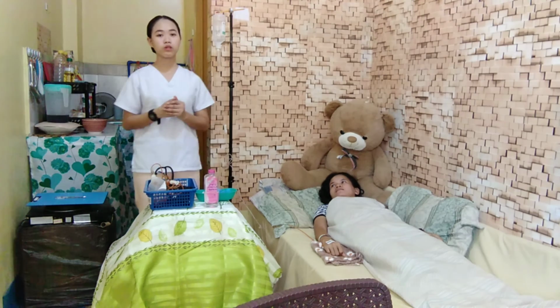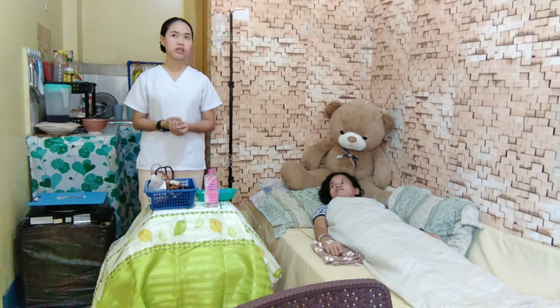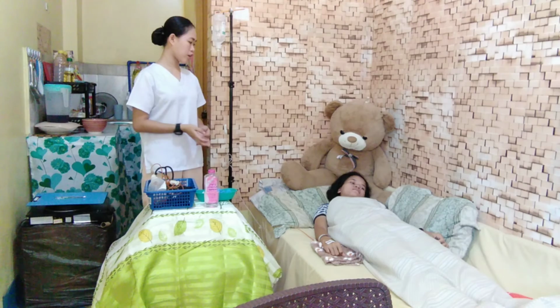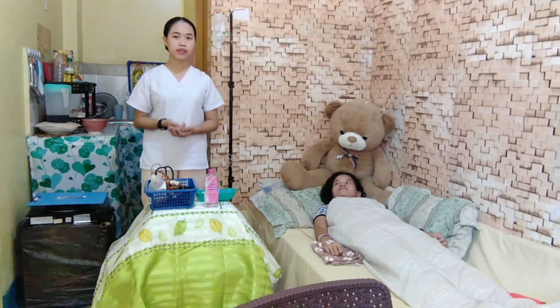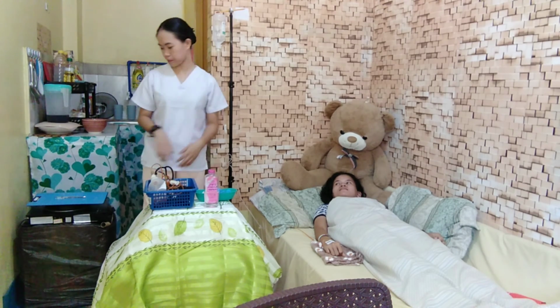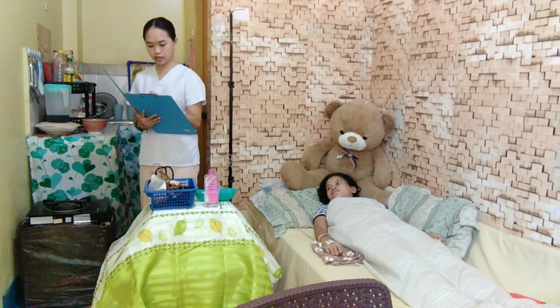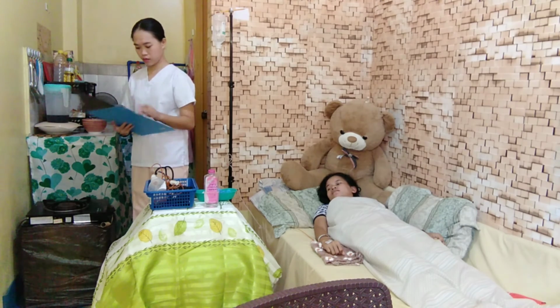And then after that, we will record the administration of the blood: the date and the time, the kind of blood group it is, any adverse reactions of the patient, the amount of blood that was infused during the blood transfusion, and also everything that transpired. So we are going to record it.